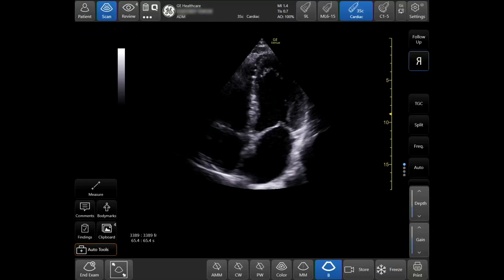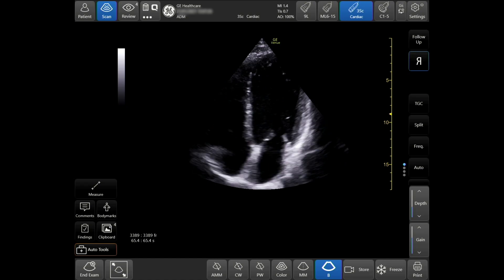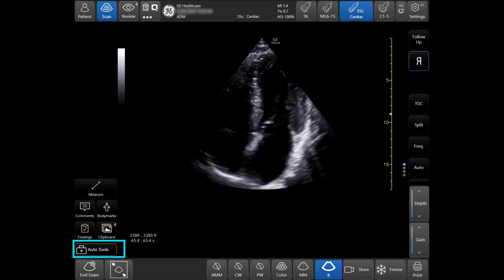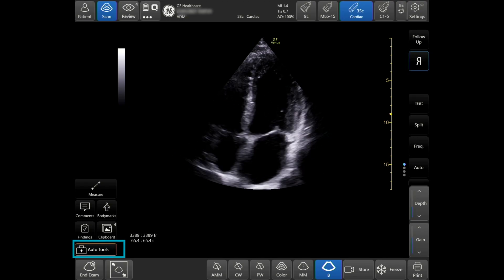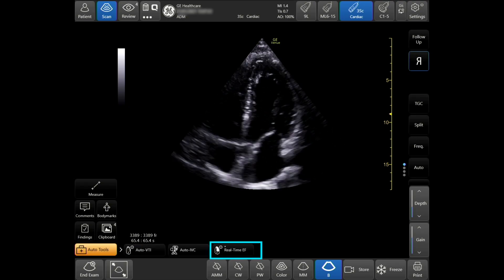Scan the patient to obtain a four-chamber view. Tap Auto Tools on the bottom left corner of the touchscreen and then tap Real-time EF.